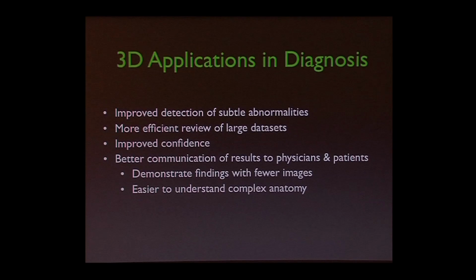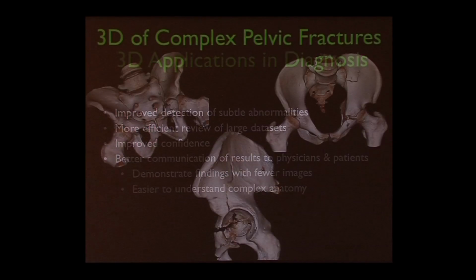And it's better communication of results to the clinicians, which means they may be able to use the results better to make better management decisions and have a better outcome with the patient's problem. And it's easier to demonstrate it to the patient. You know, what's going to happen to me? What are they going to operate on? What organs are you going to have to deal with, and what's in the way? So it's a lot easier to communicate.